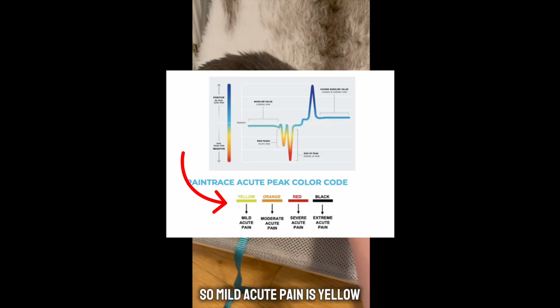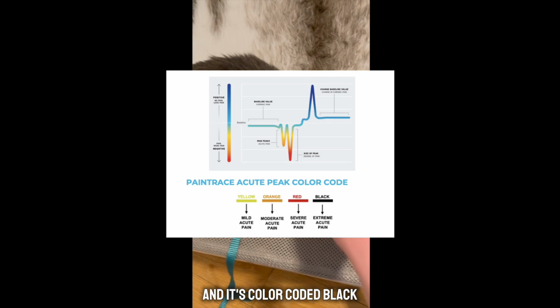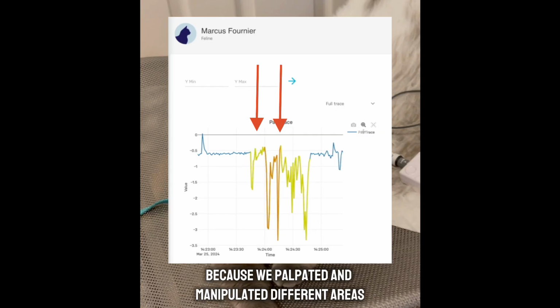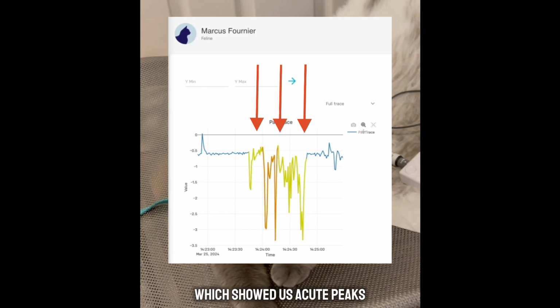So mild acute pain is yellow, moderate is orange, severe is red, and anything more painful than that is denoted as extreme pain, and it's color coded black. So the final trace here is showing us the presence of acute and chronic pain. It's also showing us the location of pain because we palpated and manipulated different areas, which showed us acute peaks.